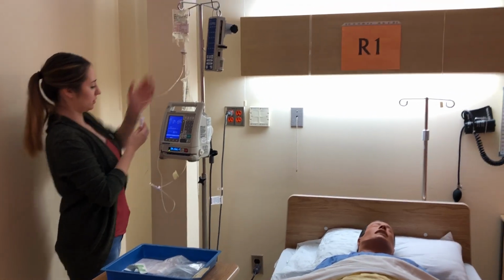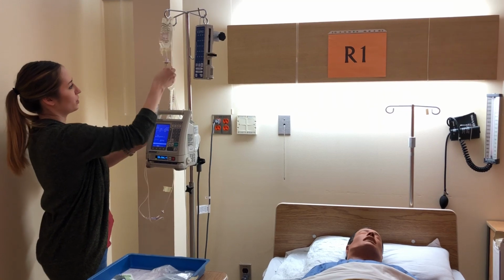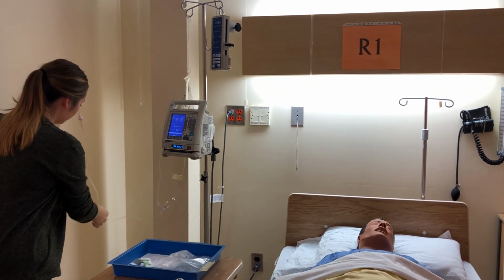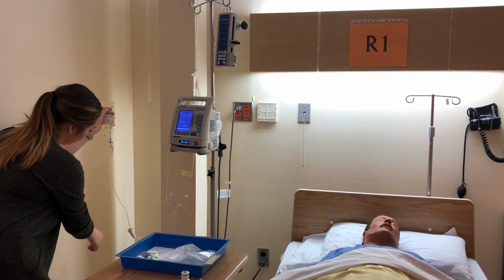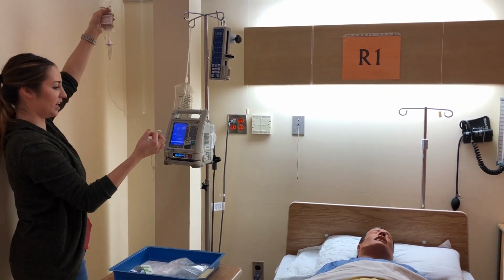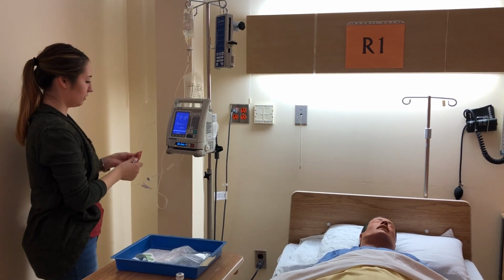Now I'm going to back prime. I'll close the roller clamp so I don't lose any drug, and we're going to fill the chamber a little bit and watch the bubbles. Once there's no more bubbles, I know that there's no more air in the line, which is good because air could be a potential hazard to the patient. I'll just double check that. It looks good.